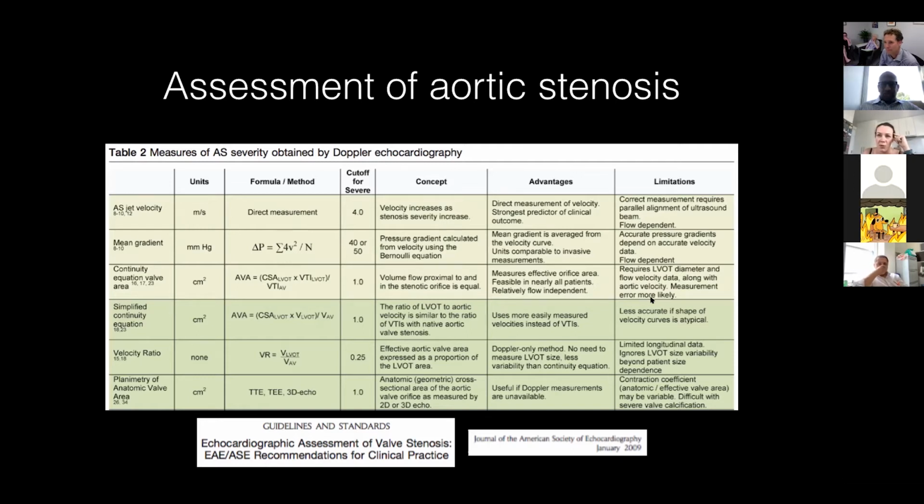You put the gate just in front of the aortic valve, so you get the closing click. Beautiful. So you don't want the opening click, because that means that you're too far in, because you get both the opening and the closing click. You just want it right at the base so that nothing's opening, but as it closes, you get the click that comes through, and that tells you that you're in exactly the same place that you measured it in the parasternal long axis view. And the last thing to say is you should zoom in on that parasternal long axis view of the aortic valve, so you make that measurement as accurately as possible.